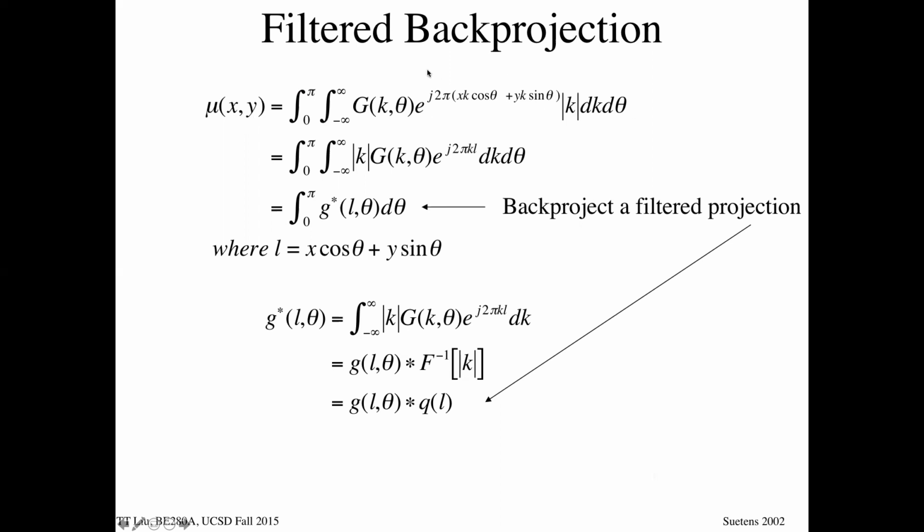Here's our original inverse Fourier transform to get from these data back to our image. And we'll gather terms up in the integral to basically use the definition of L in here for this, right? And we do the integration across dk, with this absolute value of k as the Jacobian. We're going to do that integration first in this 2D inverse Fourier transform.